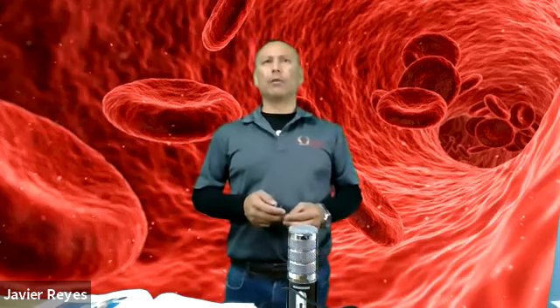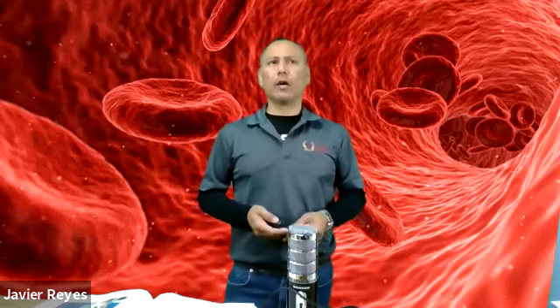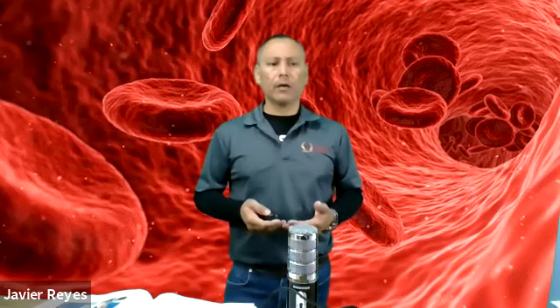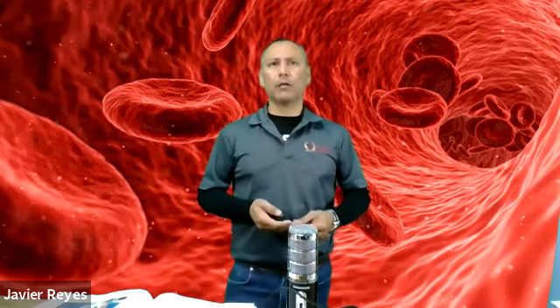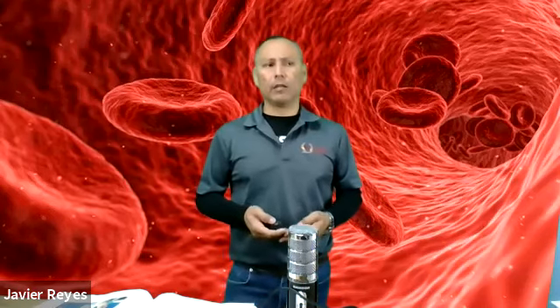All right, there's other equipment that you're going to be using as well, which is not too common. We don't collect capillary blood gases on infants very often, unless they require it because they're having shortness of breath or they're having discoloration, they look a little bit purplish, bluish, right? Or cyanotic is the term. We may need to collect capillary blood gases on these infants.